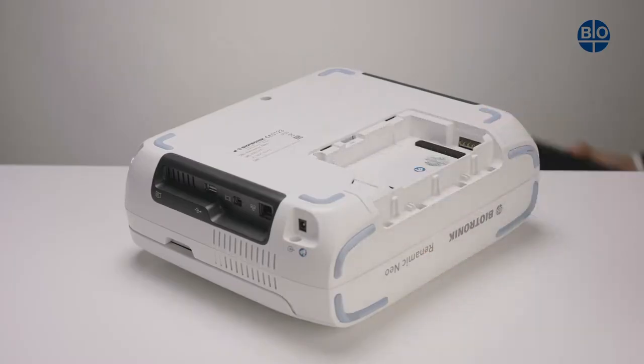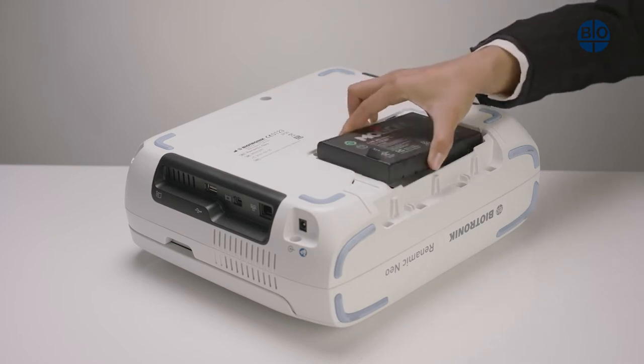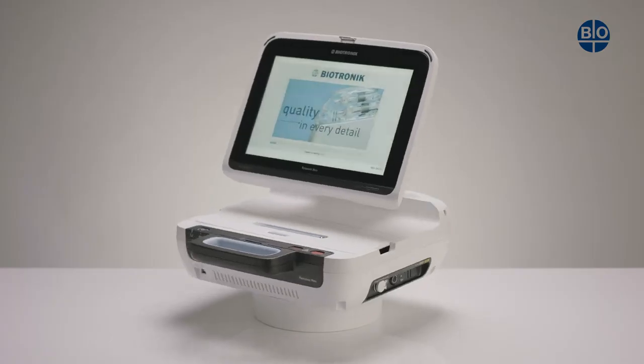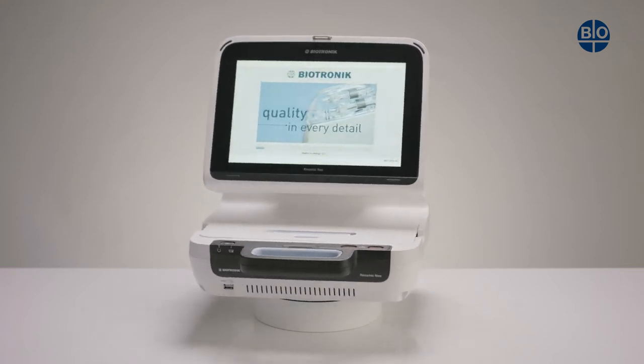The battery is not a standard component and needs to be ordered separately. With or without a battery, the RENOMIC NEO will operate perfectly with a power brick.